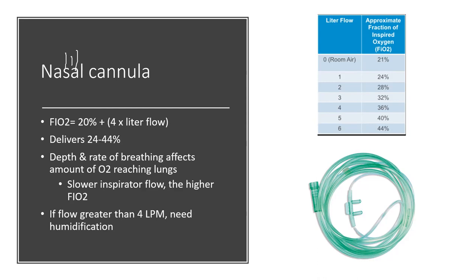Whenever we are giving oxygen, we're always going to think about the fact that it is dependent upon the depth and rate of breathing of the patient. The slower the inspiratory flow, the higher the FiO2 the patient will eventually get. The best clinical indications for nasal cannula are for patients who have a relatively stable respiratory pattern, who require a low oxygen percentage, or who only need supplemental oxygenation.